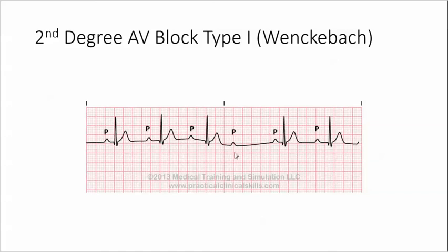Now this one does not have a QRS. Let's look into it further. The next thing we want to look at is the PRI. So we have this one, this one, here, here, and here.